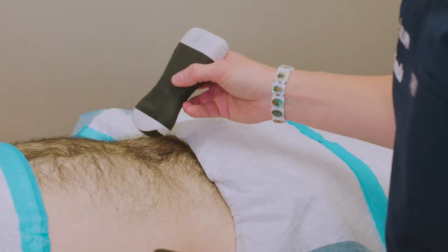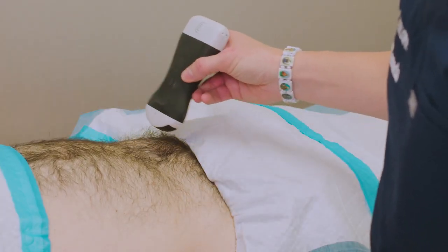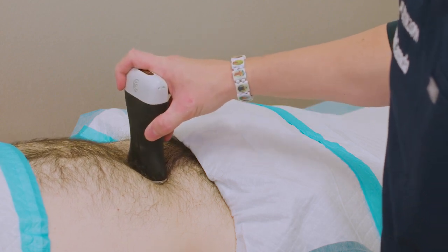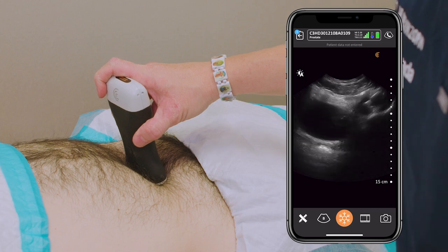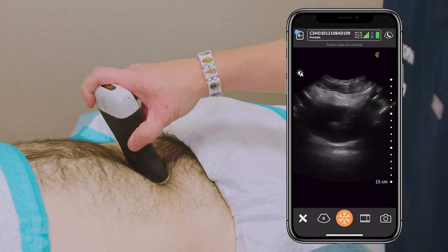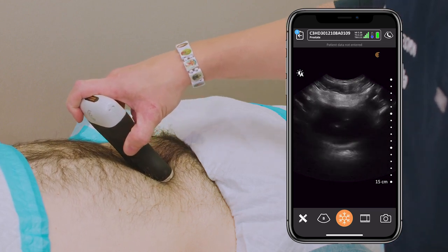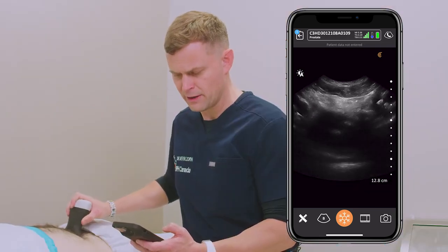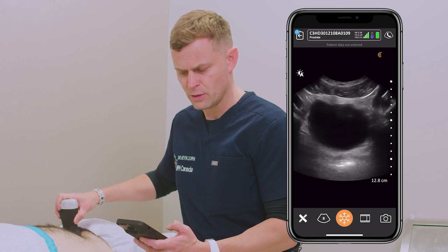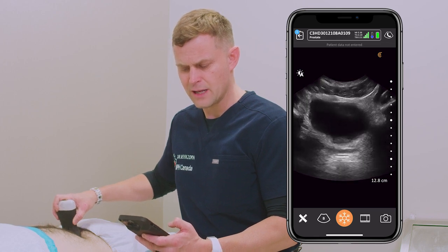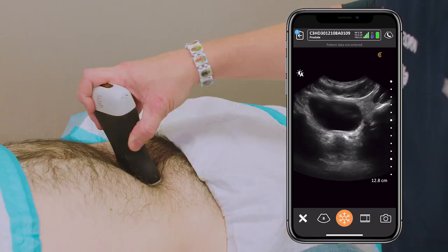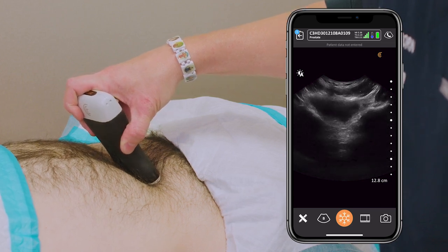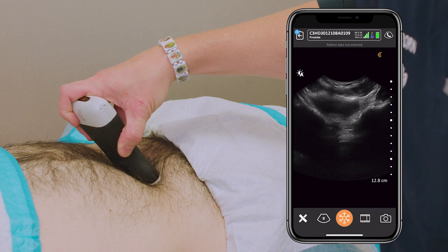I've already applied the gel to the patient's lower abdomen just above the pubic bone and I'll apply and start the filming. Up front I can see clearly his bladder. I'm going to scan and fan from the upper part of the dome of the bladder and scan downward nice and slowly, getting an idea if there's any bladder wall defects, diverticulum, and if there's any filling defects or hyperechoic areas suggestive of a bladder stone.